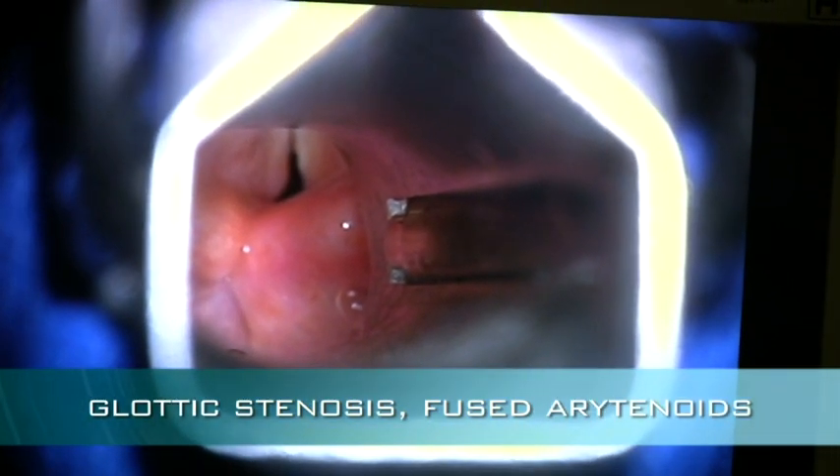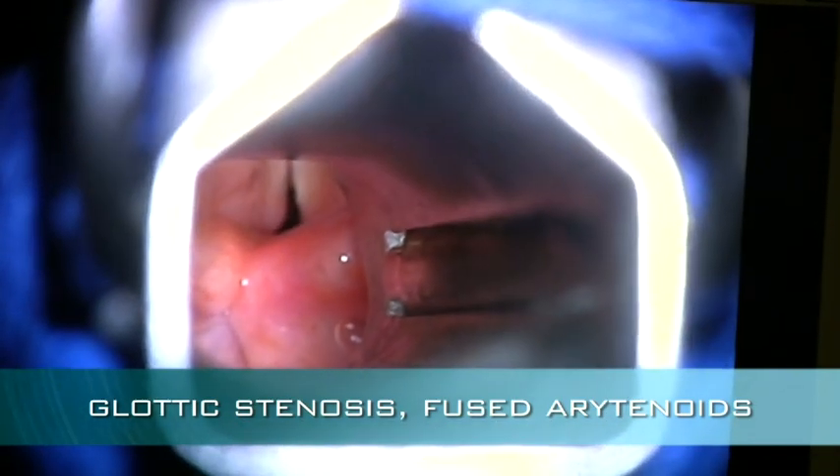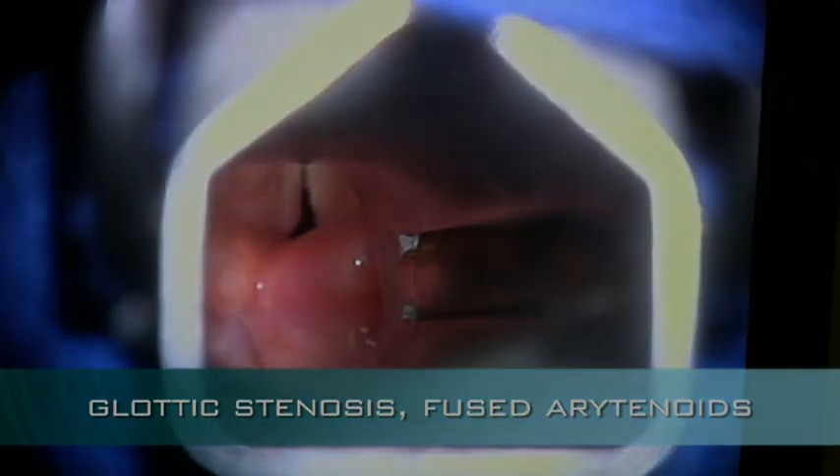This is very difficult because she is not in the best of medical health, and probably wouldn't do very well with a very large open procedure. There's too high of a risk of aspiration.